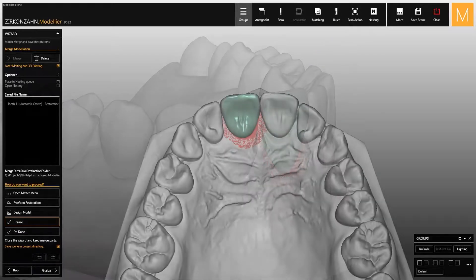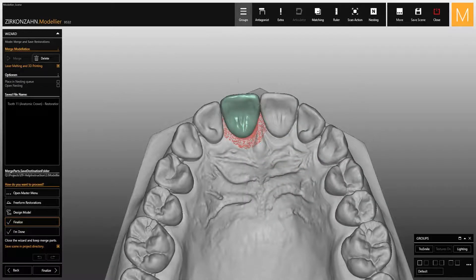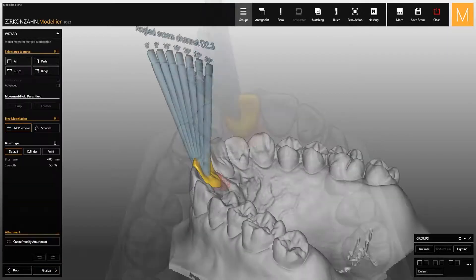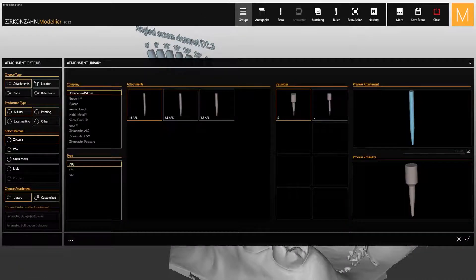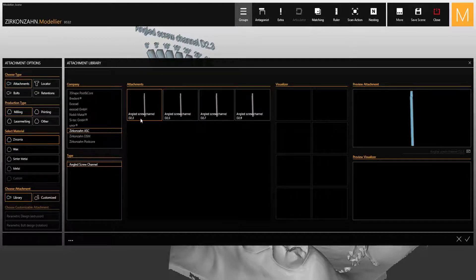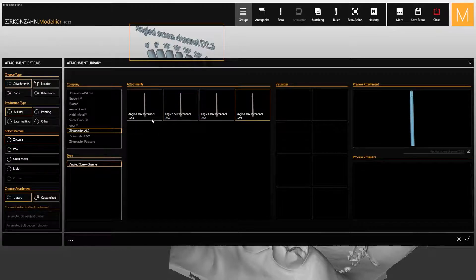To create the screw channel, the pre-visualization of the screw channel angles will be used. Click on the free modeling button and open the attachment library. Inside the window you will find different attachments. If you select Zirconzen ASC you will see all the attachments for angled screw channels, each with a different diameter. To choose the correct attachment, check which diameter is marked on the screw channel scan, then select the corresponding attachment.